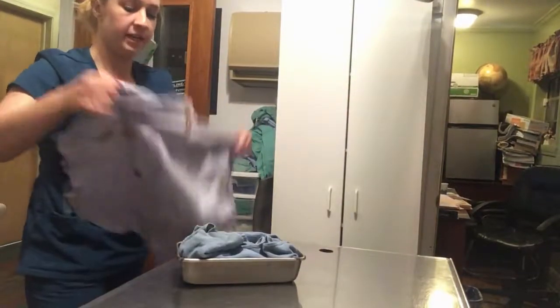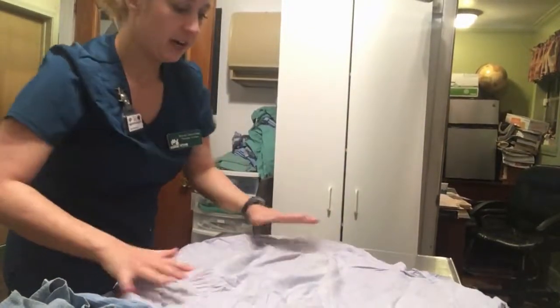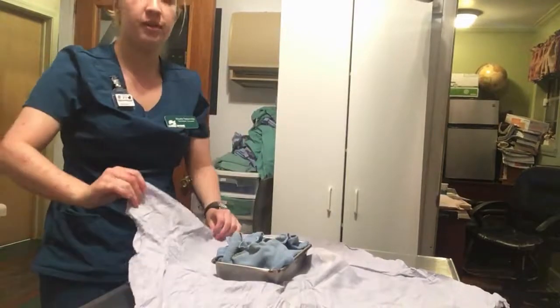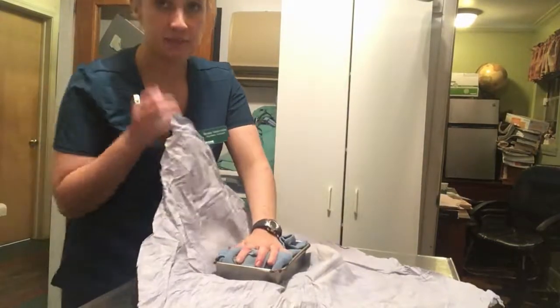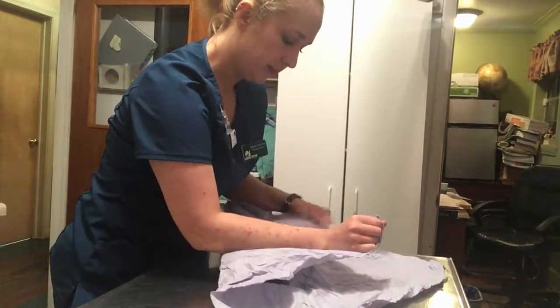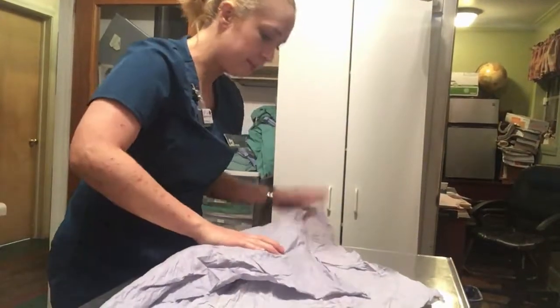Then I'm going to take my wrap and lay it out. I have this all cut and ready to go. And I'm going to place my pack right here in the middle. And then I'm going to do an envelope fold. When you're wrapping, you do want to get everything as tight as possible. That way it keeps the sterility as best as possible. So I'm going to bring this over top first to where you have your two lips to the side.